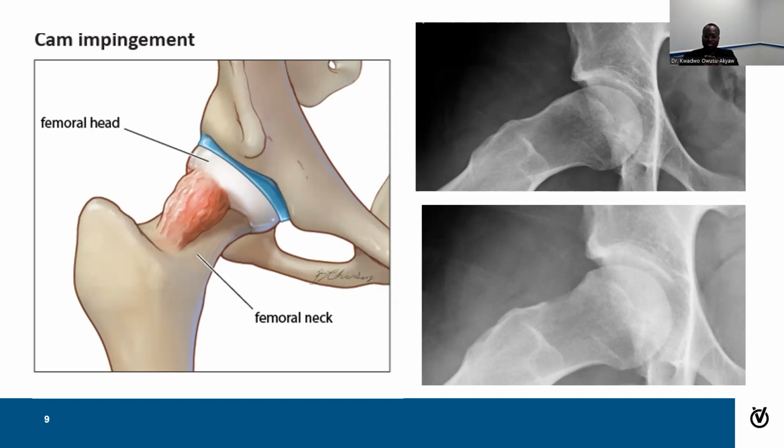The picture on the right is an example of how we smoothed out the bone for a patient who had an impingement and a labral tear. The top right shows before we did our work, and you can see that large bump right next to the ball. Then look down to the bottom right, and you can see how we smoothed that out. Now we have a nice smooth contour there, and that's not going to bump when he moves his hip around, and he can get back to playing his sport. All right, next slide, I'll show you some videos of what that looks like in real time.